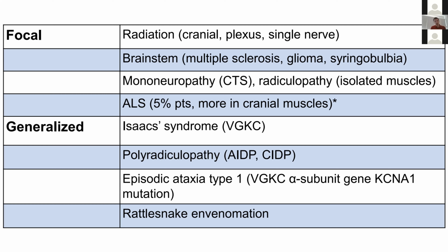And a few days ago, I had a patient with a cancer of the parotid gland 10 years ago. She got some radiotherapy, and now after so many years, she has some kind of atrophy of speech muscles and of her tongue. When we did the needle myography of the tongue, we saw this kind of myokymias. They can appear as well in brainstem disease, sometimes in a mononeuropathy, and sometimes in motor neuron disorder. Also, generalized conditions can give reason to find these myokymias.